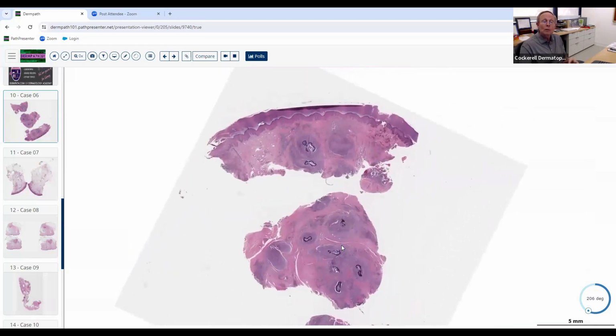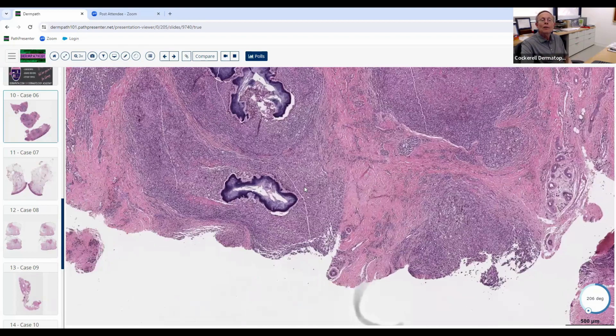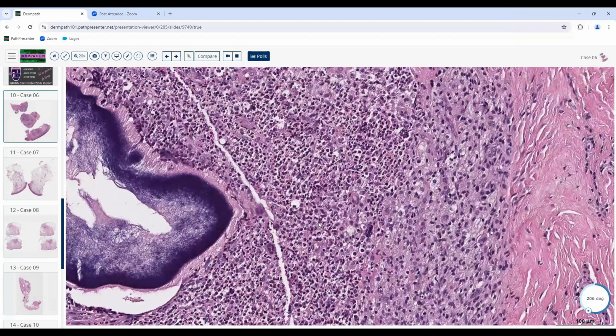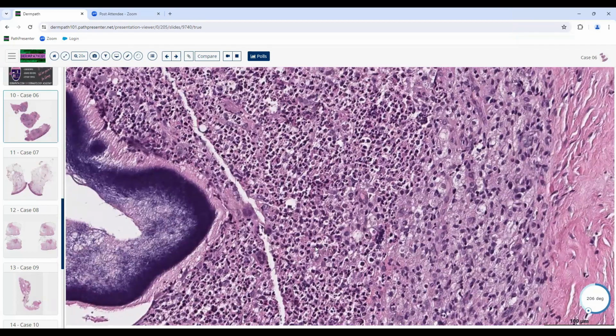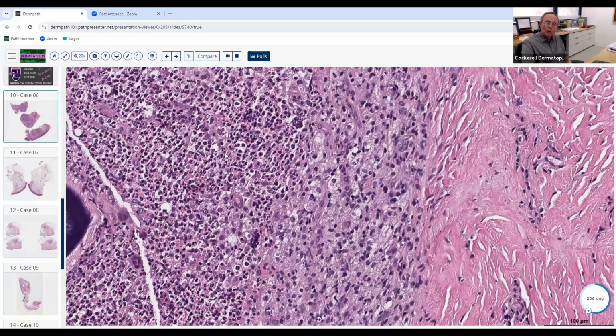Okay, so it's granulomatous. We know that there are 5 main patterns of granulomatous inflammation. Which pattern are we looking at here? Would it be like caseating? Well, you've got neutrophils here, right? Right. And histiocytes. So what do we call that pattern?